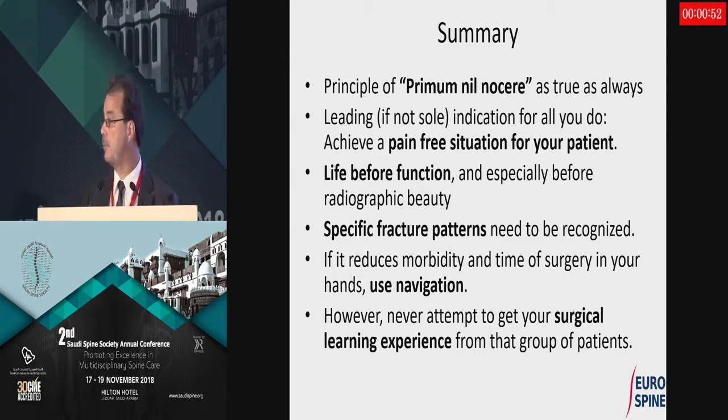Specific fracture patterns need to be recognized, as I was trying to show you, what we call the unhappy triad of C1 C2. If you recognize specific fracture patterns and acknowledge them, you may realize that it's no longer necessary to do long constructs with fusion, because some situations are already fused due to degeneration. If it reduces morbidity and time of surgery in your hands, you can use navigation. It's a helpful tool. If it lengthens time of surgery, you are at the beginning of the learning curve, and you should, and that's certainly a very important point, never attempt to get your surgical learning experience from that group of patients.